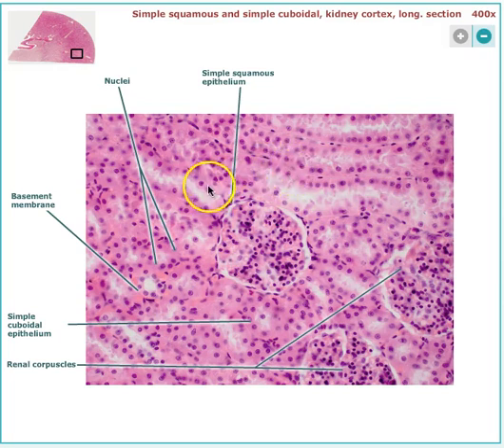So as we're looking here, the simple squamous is lining this renal corpuscle. You see these flat cells? Because remember, we said these don't exist in a vacuum. The cuboidal cells and the simple squamous can sometimes be in the same environment. So here, highlighted in yellow, you see these thin flat cells. But then when you go over here, I'm just going to outline it with the mouse. See? You can see that you have these cube-like cells.